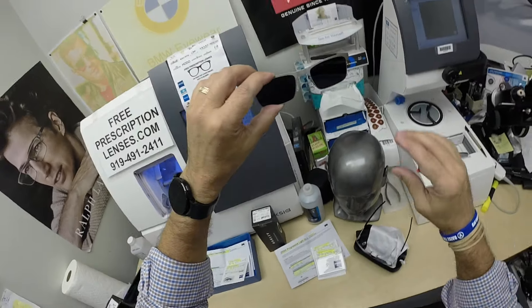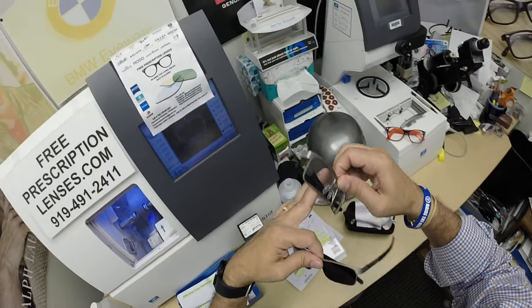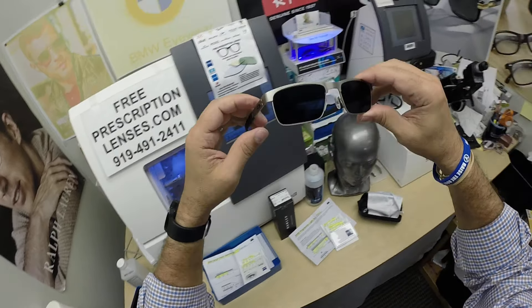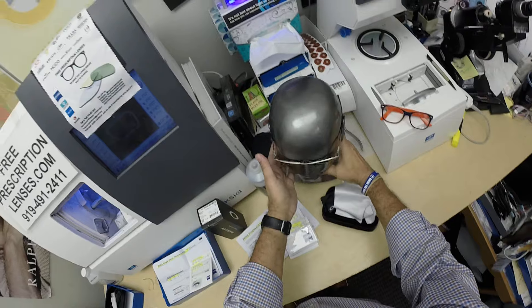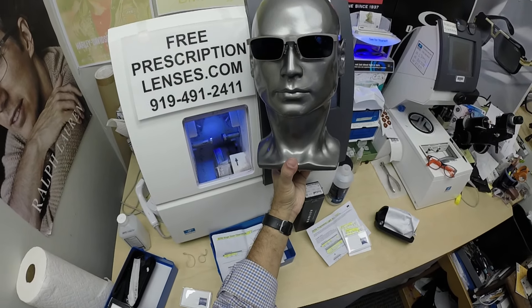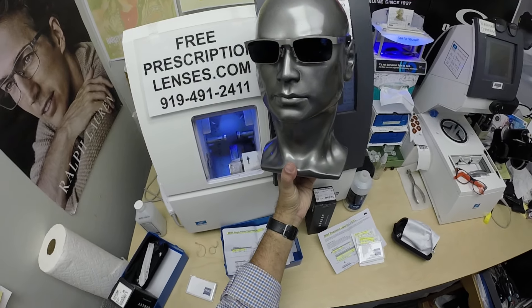The other thing about photochromic lenses is they are temperature sensitive — I might as well do dad's while I'm here. They're temperature sensitive, meaning they will get darker when it's 85 degrees and below than they will when it's 95 and above. But I remind everyone: when it's 100 degrees outside, you're miserable, they're miserable — nobody or nothing works 100% when it's 100 degrees outside. We all work much better when it cools off.